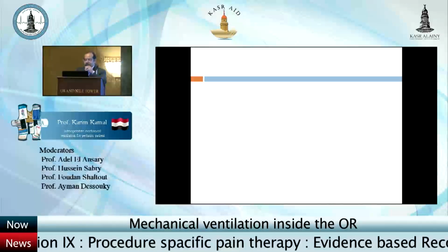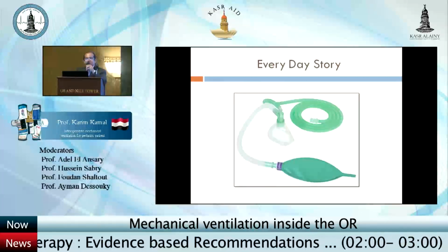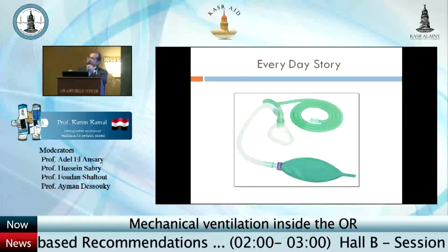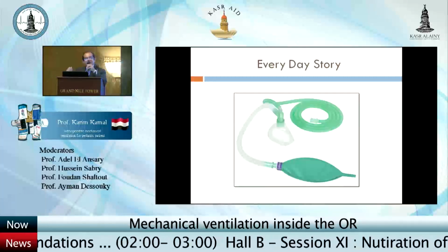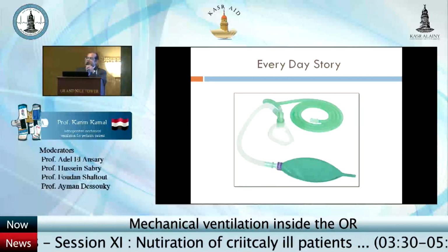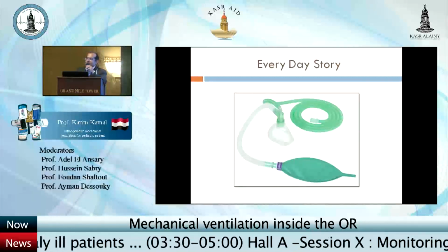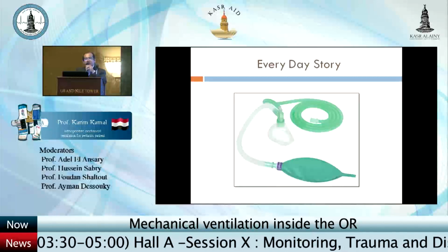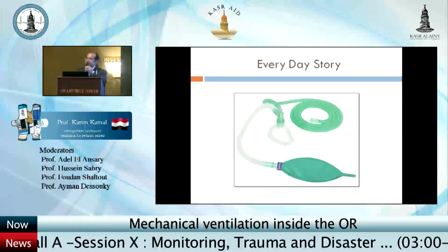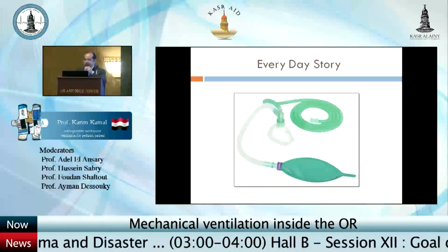He would use an Ayre's T-piece. Okay, that's the answer to his problem. He will just connect the Ayre's T-piece and bag the baby for the two hours of the operation and relax his mind. Of course, this is not the right answer. I'm sure we can all agree that Baby O will be much better off put on a mechanical ventilator than being bagged with an Ayre's T-piece.